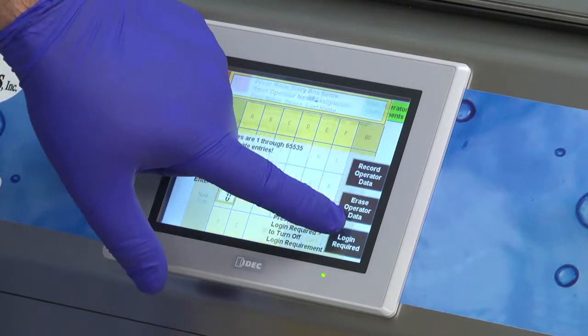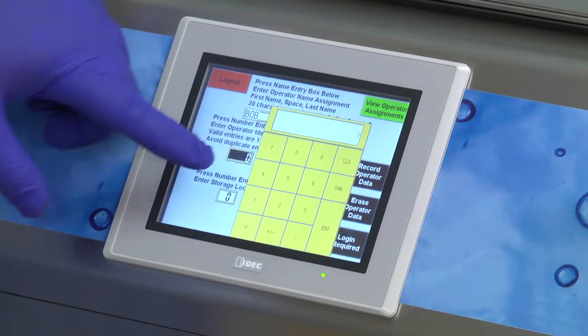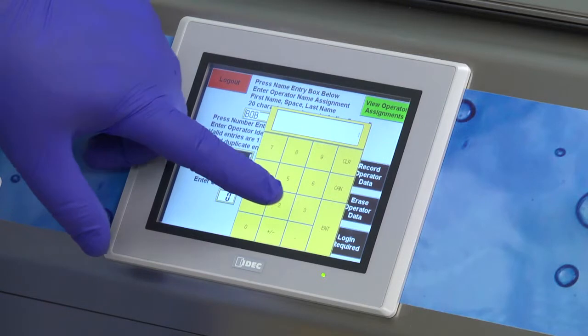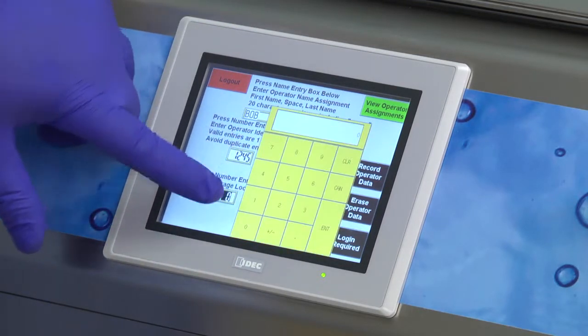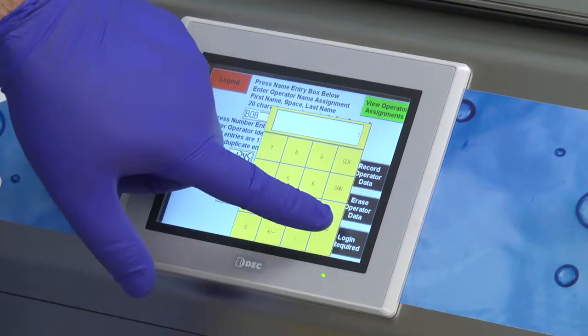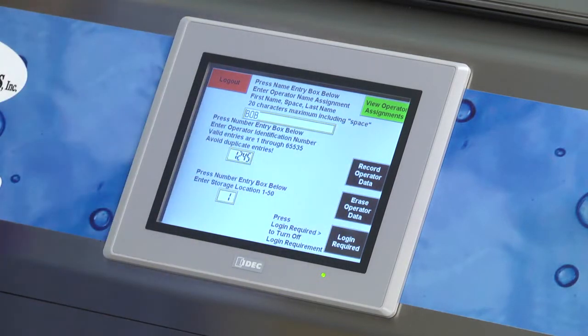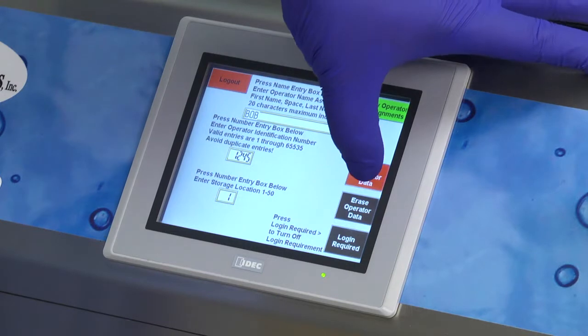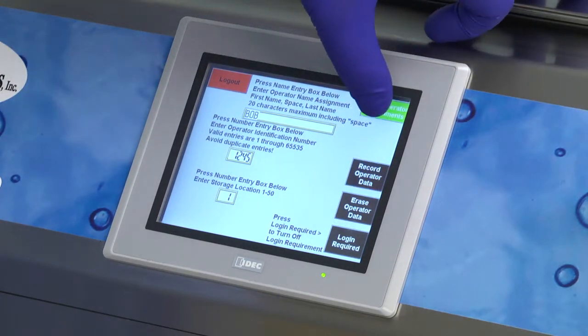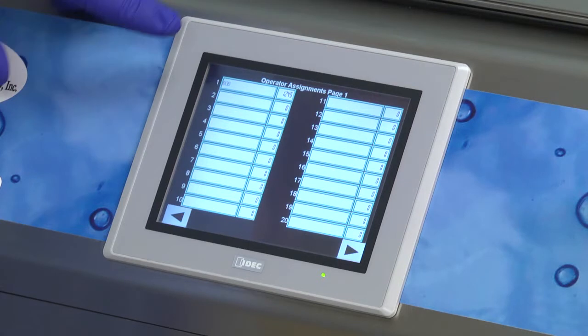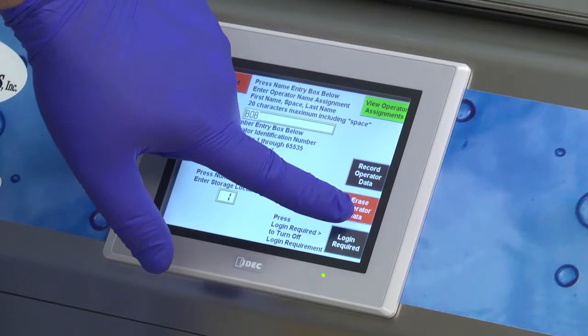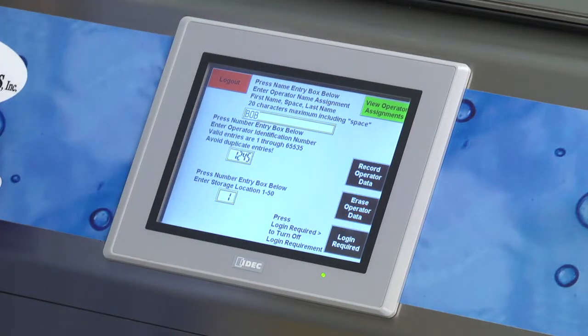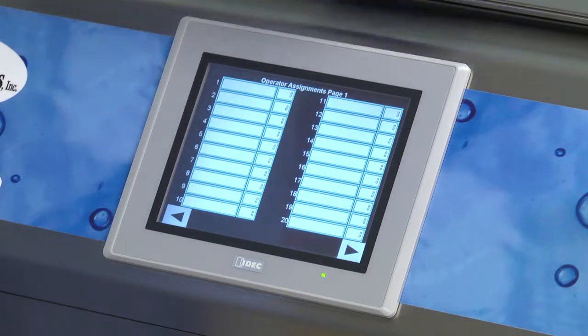To enter their identification number, press the Number Entry box and type their ID number, followed by pressing Enter. To assign their storage location number on the Operator Assignments log, press the Number Entry box and assign their number, followed by pressing Enter. Once all of the information is entered, select Record Operator Data to create the new operator login. To delete a login for a particular operator, enter in all of the operator's data, then press Erase Operator Data. This will remove the operator login from the assignment list and prevent operation by that user.